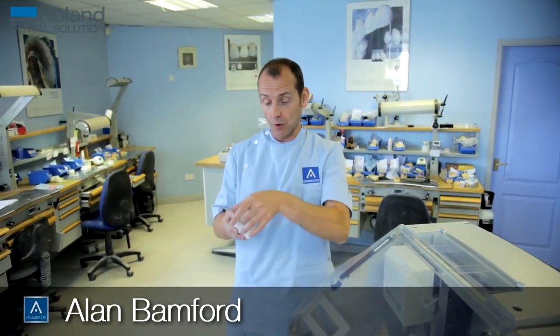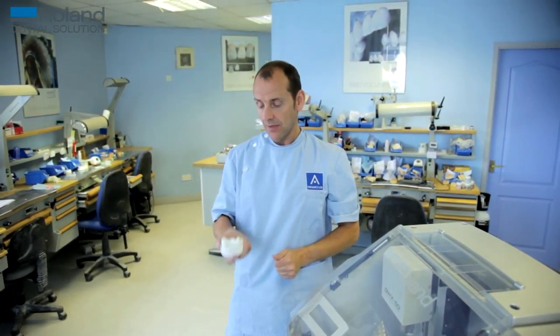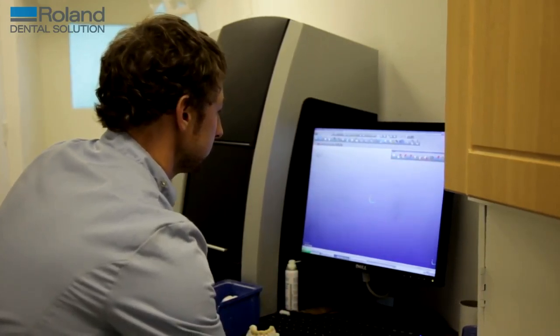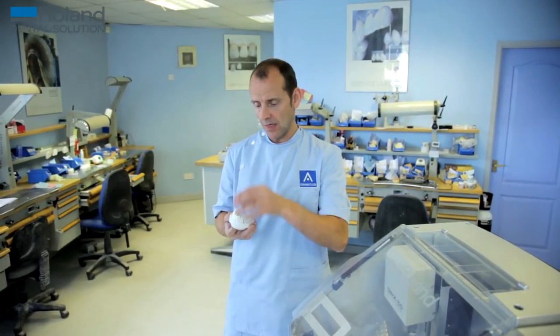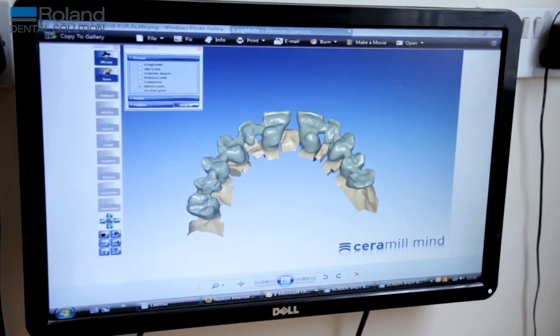I'll run through the process. First of all, you cast your model like you do in normal crown and bridge. Then you'll put this model into a scanner. The scanner will take pictures of the model and then you will design whatever you want onto that model.